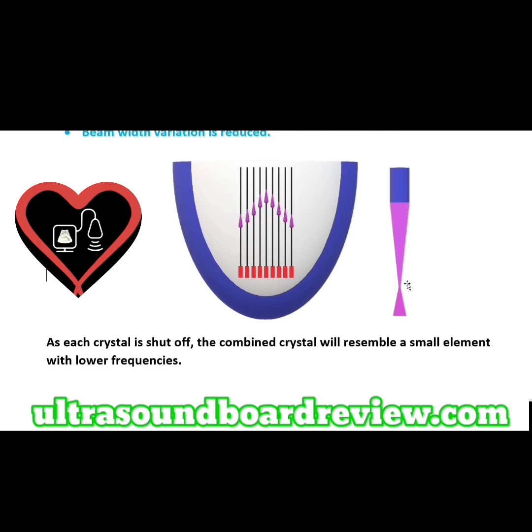We're increasing our penetration. That's exactly what happens when you increase your frequency. You extend your near field or your focal depth, but your penetration does not increase. In fact, your penetration decreases when you increase your frequency. That's why we have this dynamic aperture, because to make up for the penetration, this helps us extend it into the far field. If we're just talking about high frequency, if we increase our frequency, that means that we're going to image more shallow and our penetration decreases. But with this dynamic aperture, we can extend the Fresnel zone or the focal depth to change the focal or the focus at this level here.